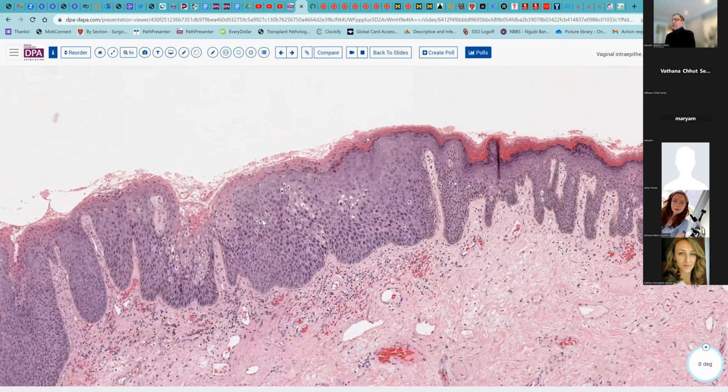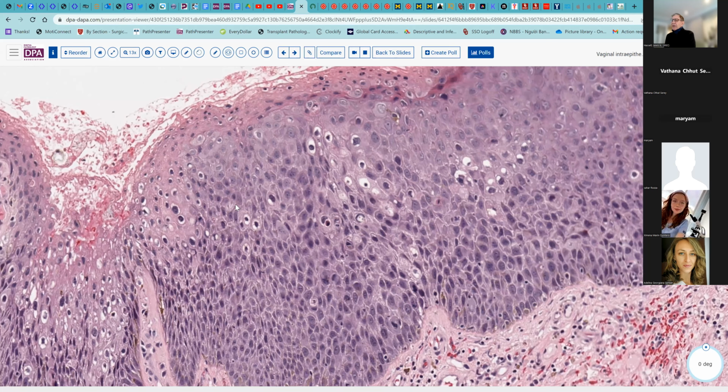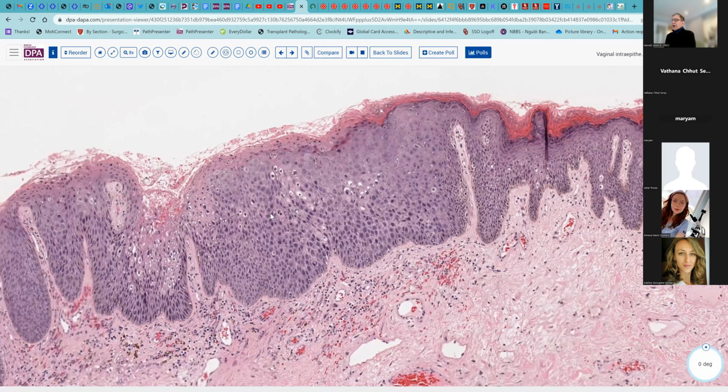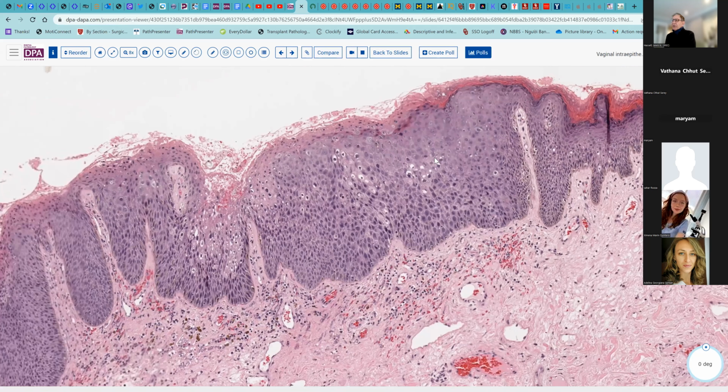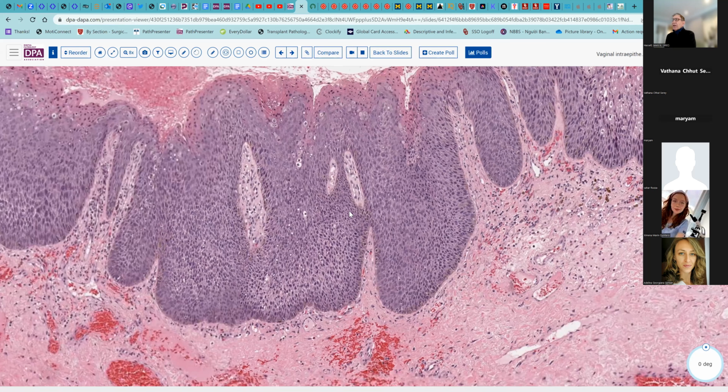Because we still have a fair amount of cytoplasm up here, under the old system, this might still be called a vaginal intraepithelial neoplasia grade 2, or VAIN 2. But that's immaterial, because it's high grade, it does need obliterative therapy to salvage the patient's good prognosis while it's still an in situ lesion.